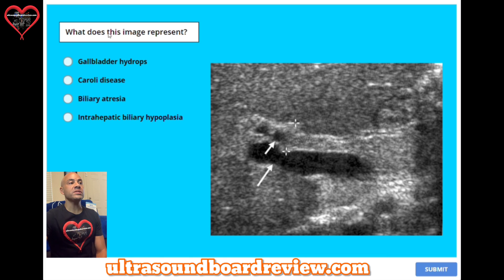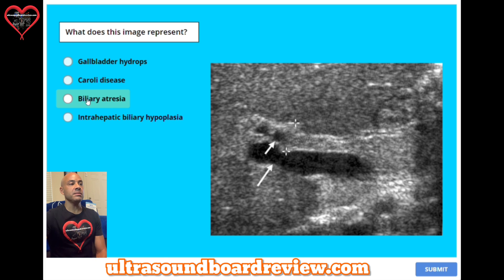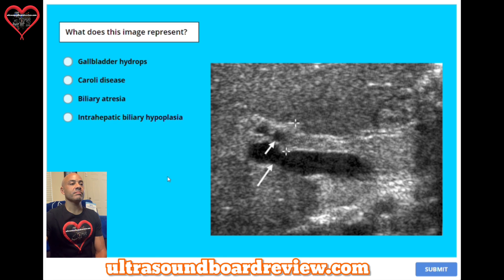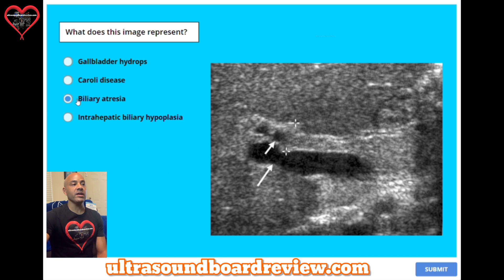Question 49. What does this image represent? A: gallbladder hydrops. B: Caroli disease. C: biliary atresia. Or D: intrahepatic biliary hypoplasia. The answer is C: biliary atresia.